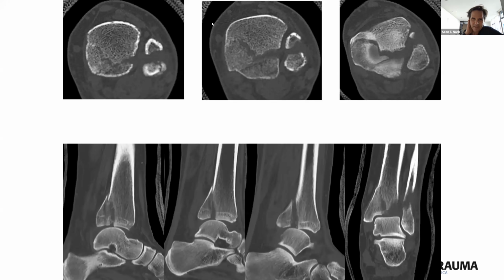What you don't see well, though, or we certainly discovered intraoperatively, is right there is some callus, but I think it's impressive how much more healed this turns out to be than the CT would suggest. Someone might look at that and say, I'll just clamp it. Do not be fooled. Does anyone have any thoughts on how to attack this?